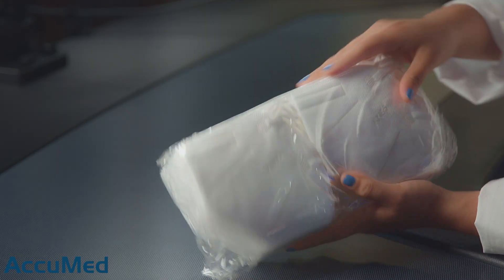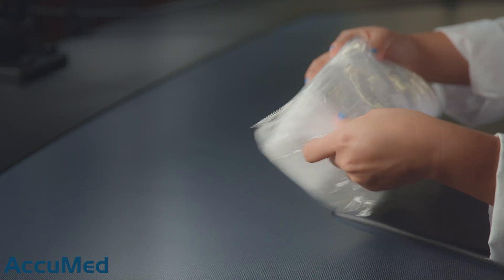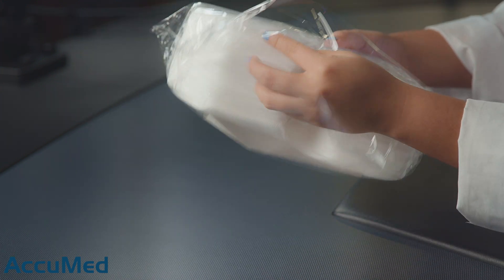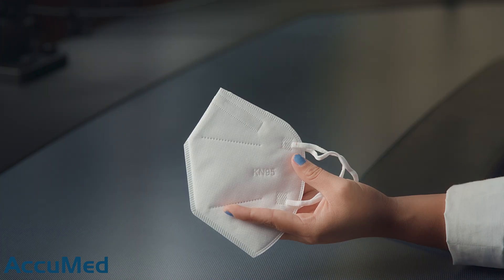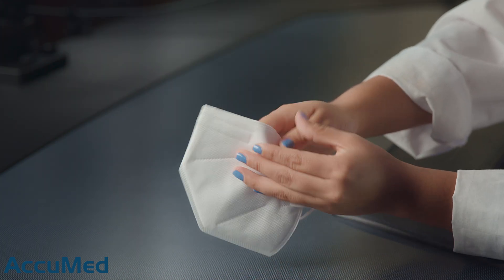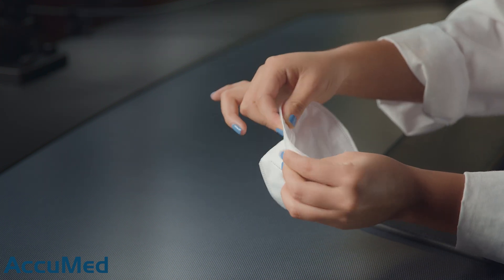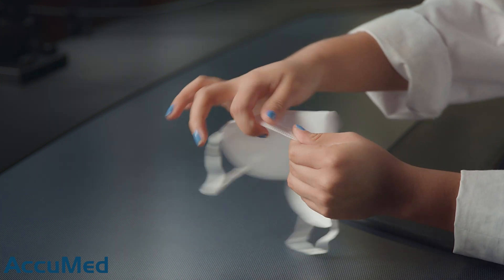Let's go ahead and take a look at these masks before we run them through our TSI machine. They come in just one big bag. Let's take one of these out. They are a little bit on the thicker side. Let's take a look at the nose wire — that's a pretty standard nose wire, it's not too flimsy.